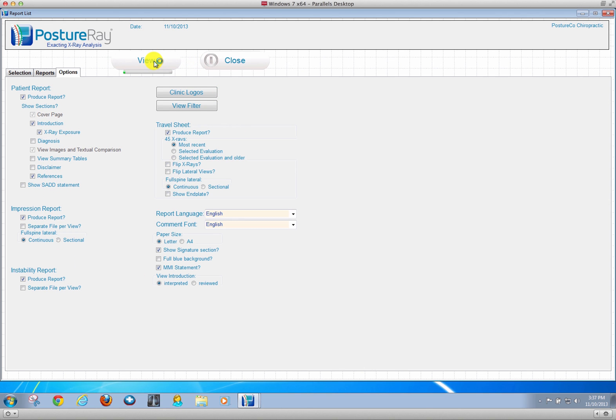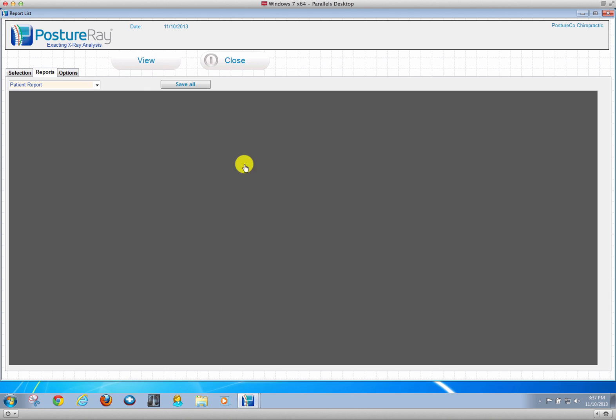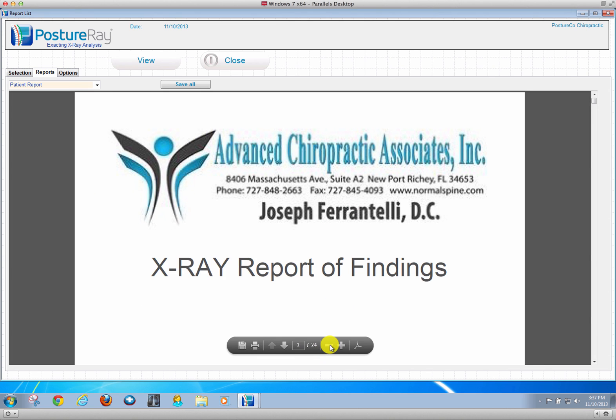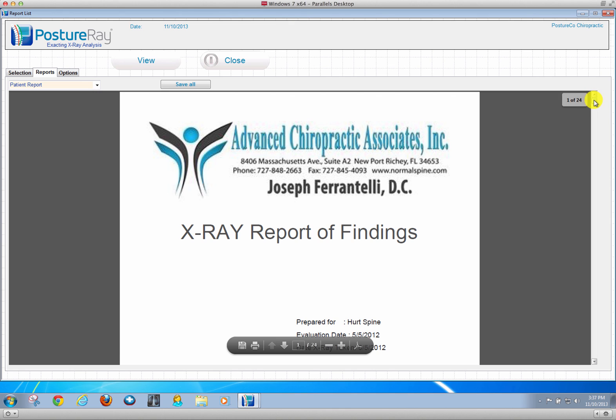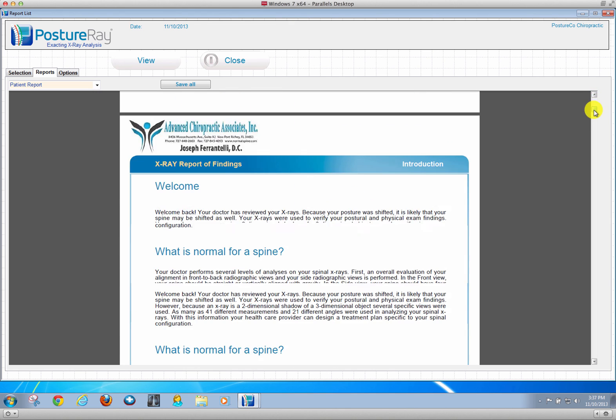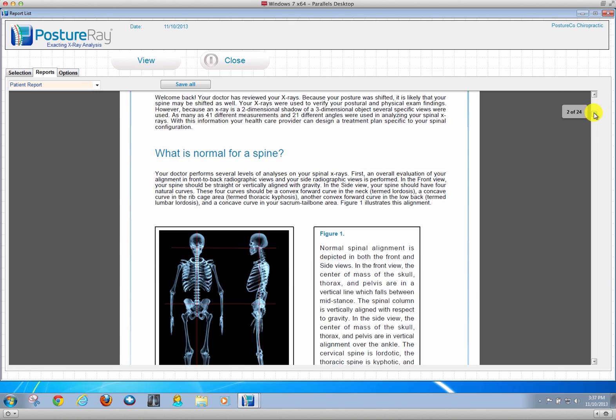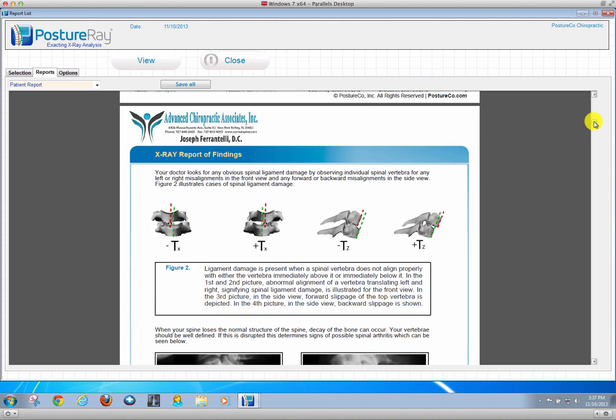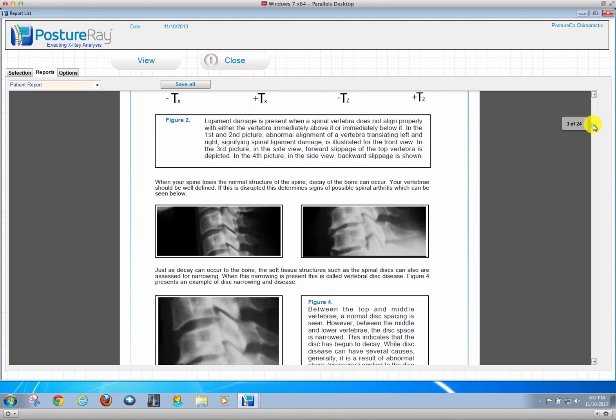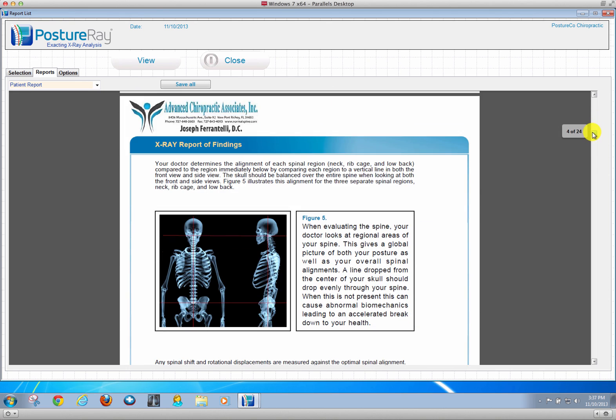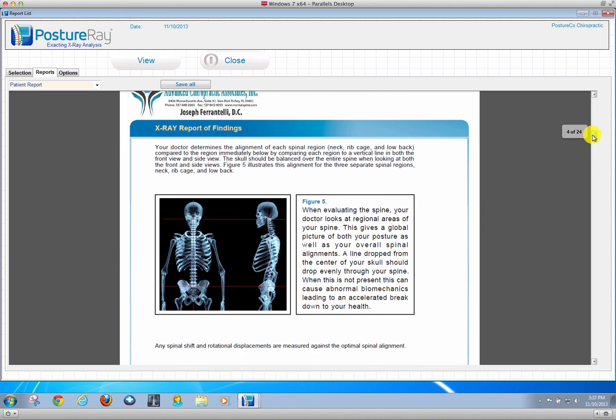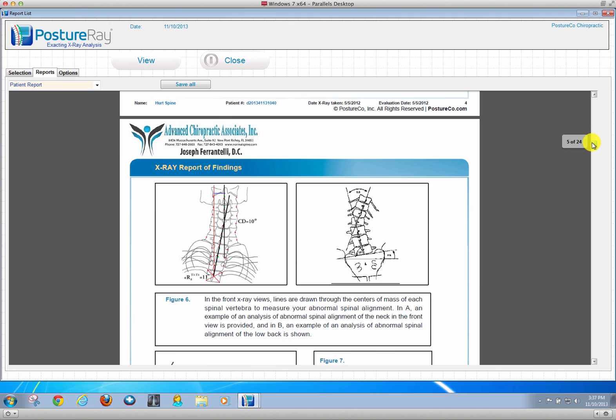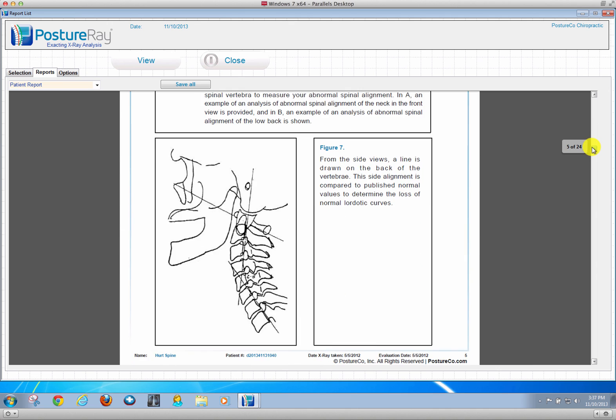Then it's going to generate the PDF documents just like in the CBP version except this is Clear technique specific. You get a patient-friendly report of findings. I'm going to zoom out so you can see. In that patient-friendly report, we go over what subluxation is, normal position, why we measure x-rays.